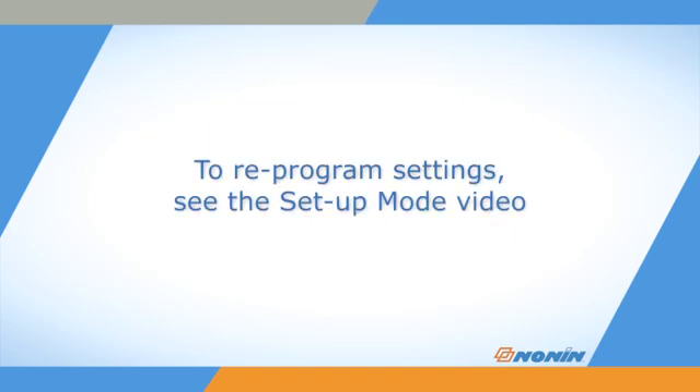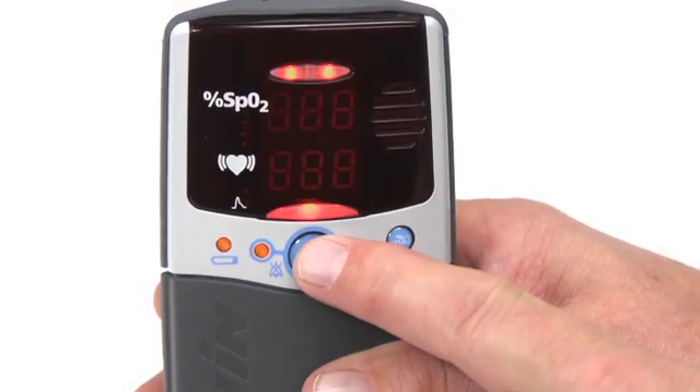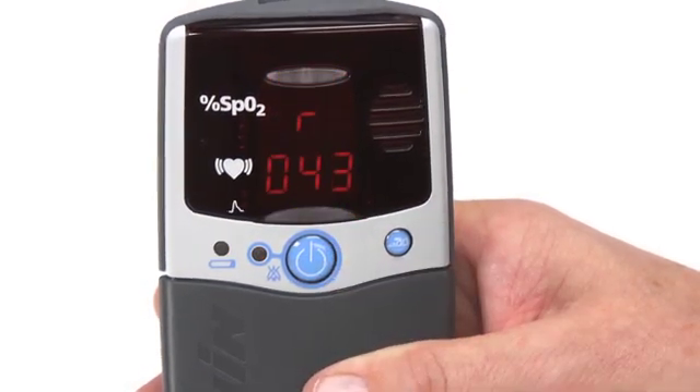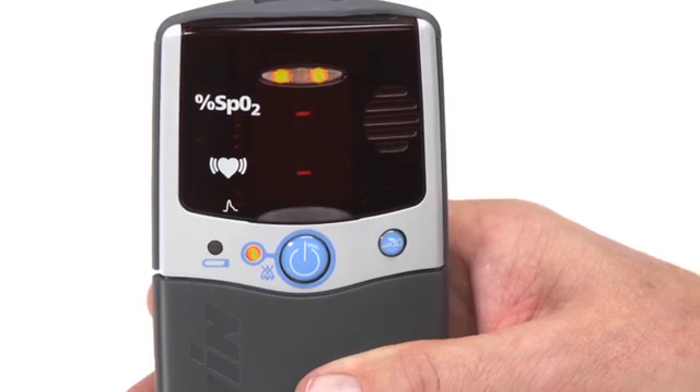If you lose the settings and stored data on the oximeter, you can reprogram the settings using the setup mode described in the 2500/2500A setup video. If the oximeter has been in regular use with regular battery changes or recharges, the settings should be retained in the oximeter for its next use.